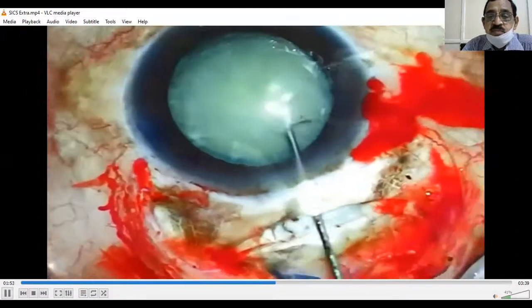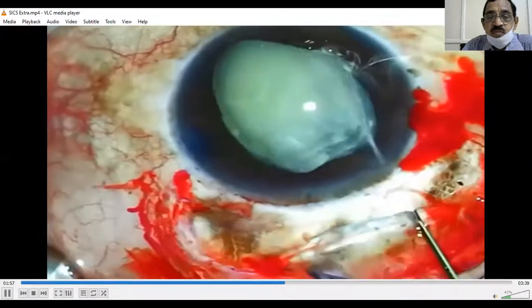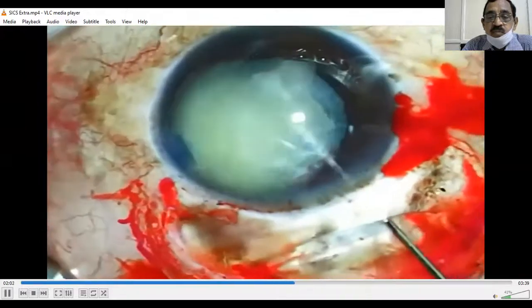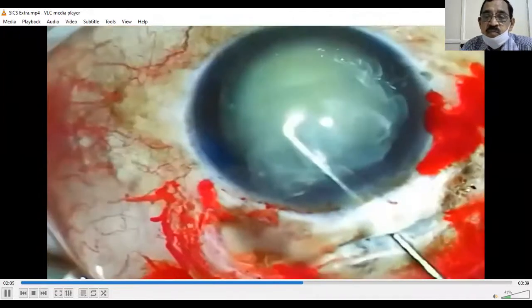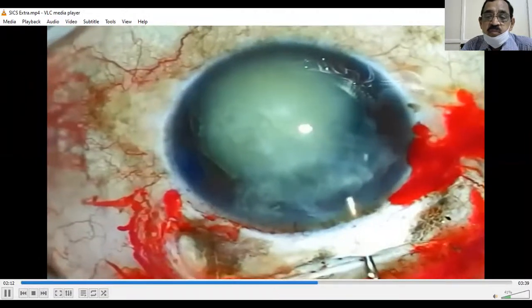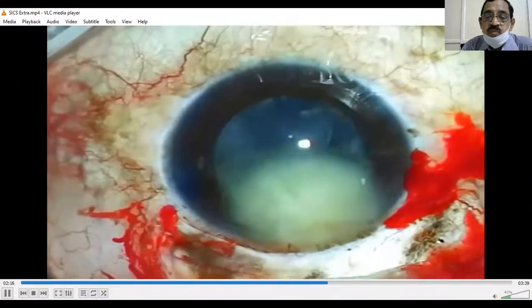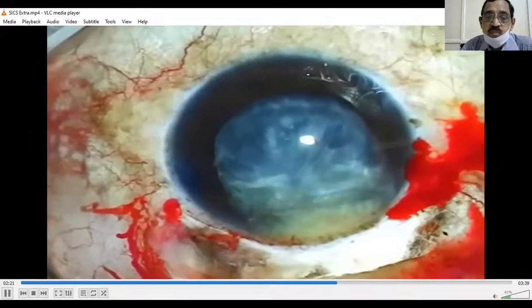The Chang cannula is used to perform some hydrodissection, and you can see that this lens nucleus very easily rotates up and out of the capsular bag. In this step, it's important to make sure that the lens nucleus is in the anterior chamber and is not in the bag anymore. Next, viscoelastic is injected underneath the lens to help the lens come into that incision we've created. Here you can see that the lens already essentially exits the eye.